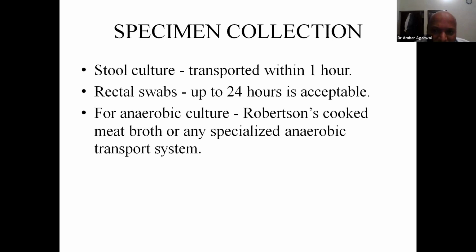Now, for stool culture, they say that it has to be transported within 1 hour, but if you send it in a transport media, it can still be done up to 24 to 48 hours. Rectal swabs, they say that up to 24 hours is acceptable.